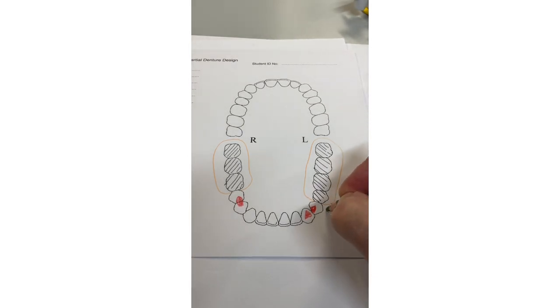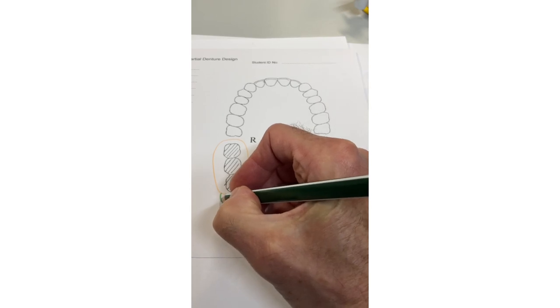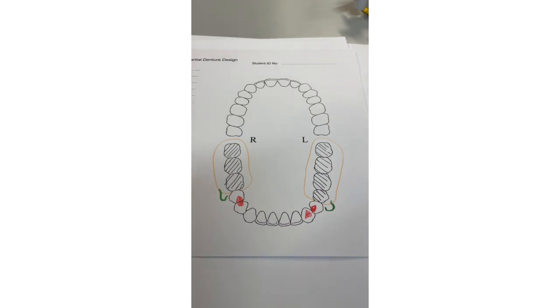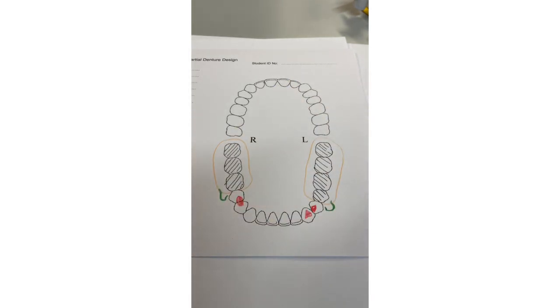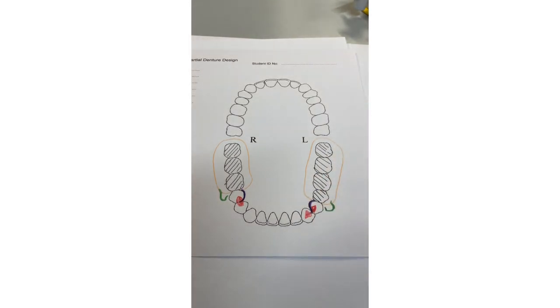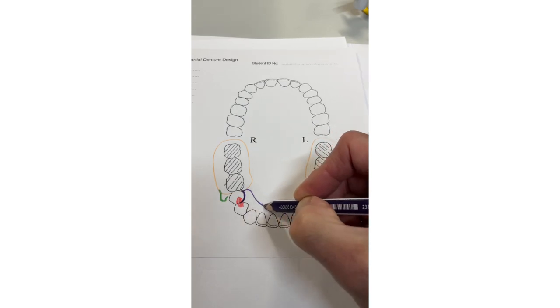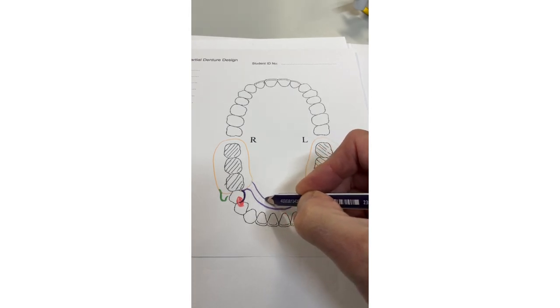Now we've got support, we need some retention. Use gingivally approaching clasps on single-rooted teeth — a half-T shape here, less visible but just as effective, and the same on this side. These clasp arms are minimum 13 mm long, which is fine. We need to reciprocate: clinical crown height is very good on both these premolar teeth, so no reason why we can't do arms to keep it gingivally free. Bring an arm around here linking both rests to the denture base, and run around here to link the other side — arm reciprocation for both teeth. Then bring a lingual bar all the way around to make the denture base rigid.